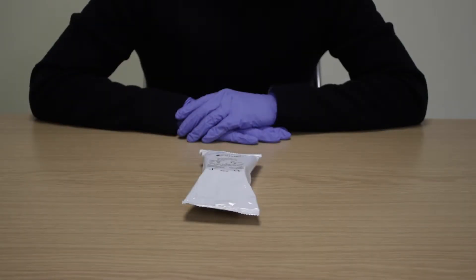Welcome to our product and user guide videos. Today we're going to demonstrate how easy it is to use the ScreenPro Oral Fluid Drug Test. The ScreenPro Oral Fluid Drug Test is a qualitative point-of-care screening device for the rapid detection of drugs and metabolites in human saliva.